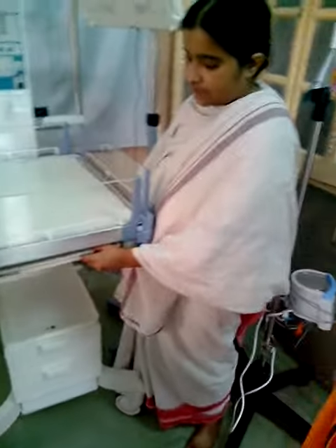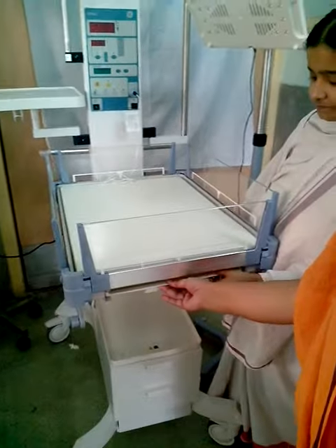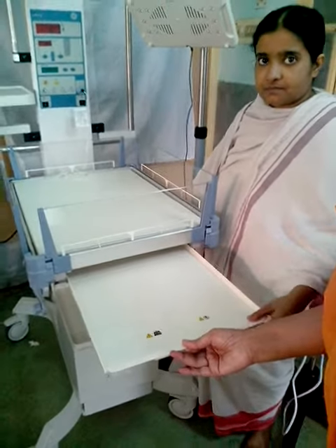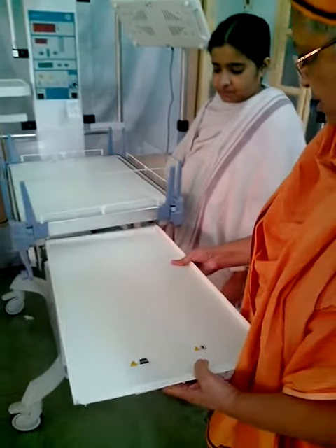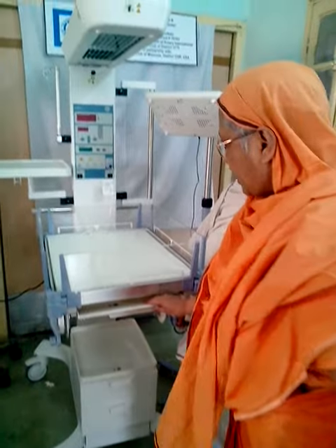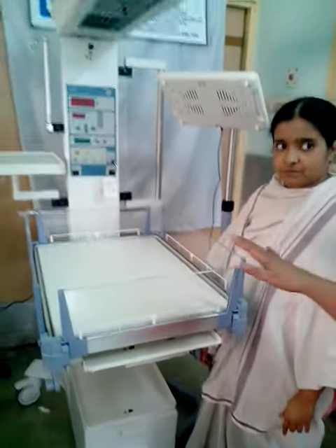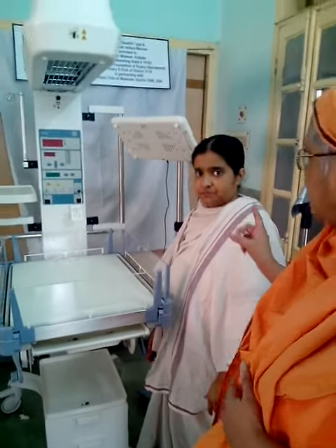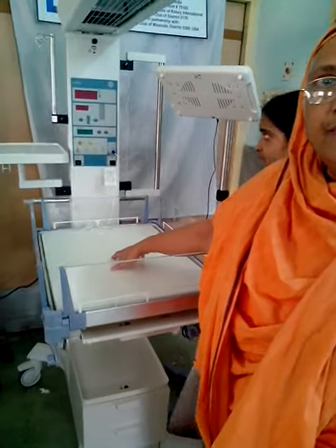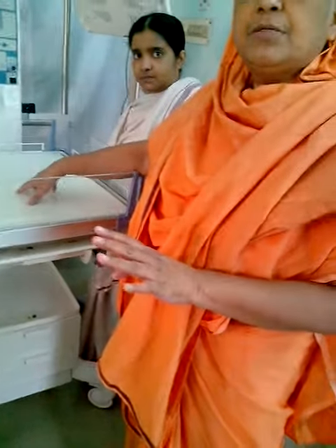When we want to do an X-ray, we can put the X-ray plate here. The X-ray plate will be here, and then they take the picture. Otherwise, what basically has to happen is you have to remove the baby, and if you have to remove the baby, it becomes problematic. In the same position, you can do it.